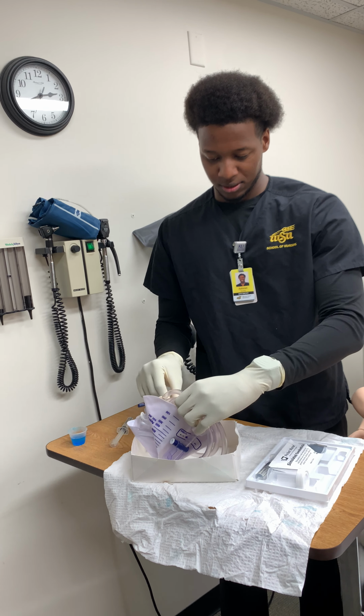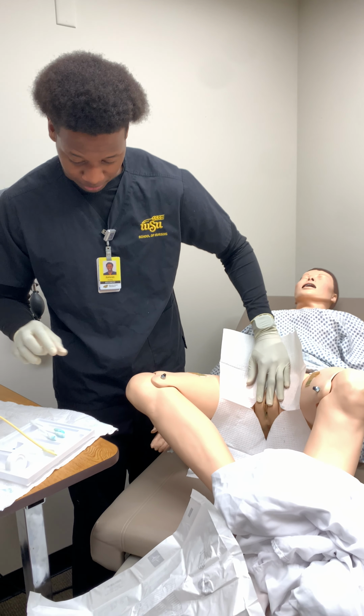In this case, I'll lube this up very well. Let it sit there. Then we'll also attach the balloon over here. So after doing all that, we'll start by sterilizing our patient here. So we have 3 swabs. We'll start by placing the swabs here. Use my non-dominant hand to separate the labia.